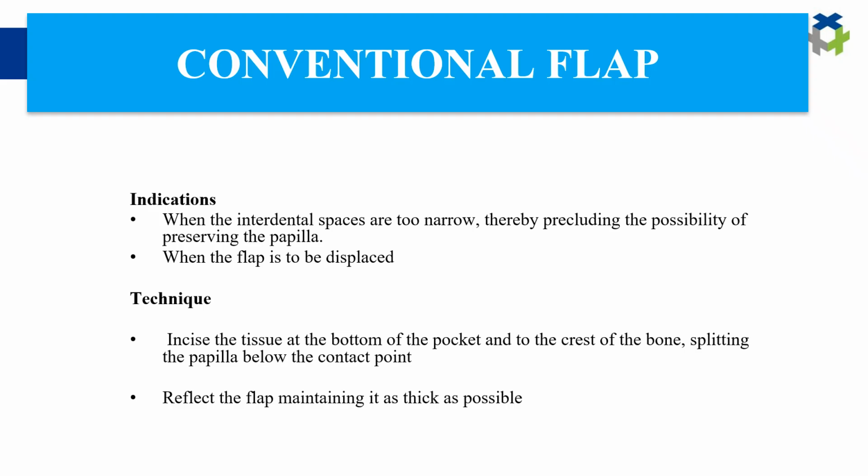And papilla preservation flap by Takei et al. in the year 1985, it is indicated for wide embrasures. It preserves the papilla for better aesthetics. Technically, it is more difficult and it is time consuming, but it prevents the post-op tissue craters.